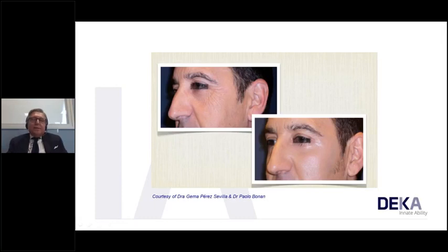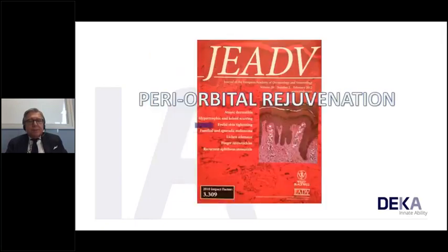And we have the same results that we got with the prior traditional resurfacing laser, but which took several weeks or months in recovery time. Now we can get the same results with a shorter recovery time. I would say that we can get a peak redness around 24-48 hours, as seen maybe in this case, in the periorbital rejuvenation.